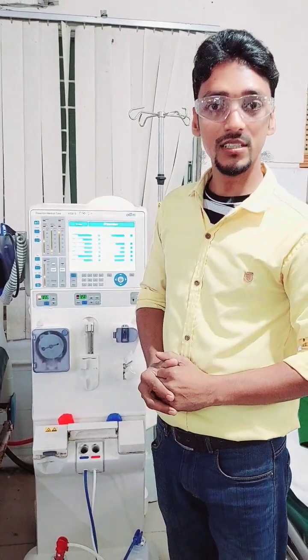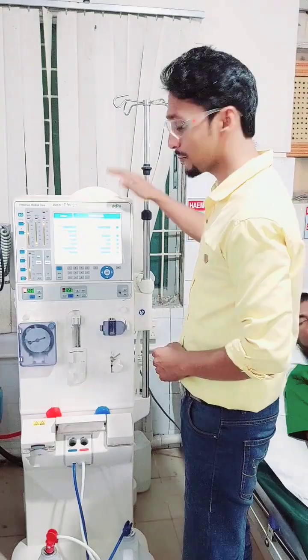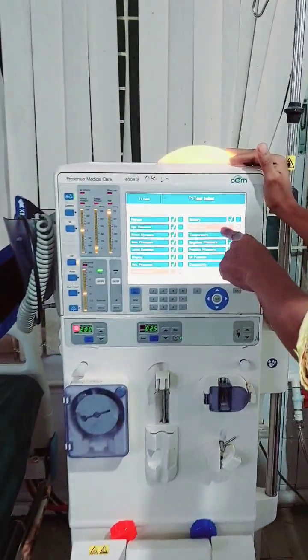Assalamu alaikum everyone. Welcome to MediScience Engineering and Technology. I am proud to present how to solve the dialysis machine blood leak problem.